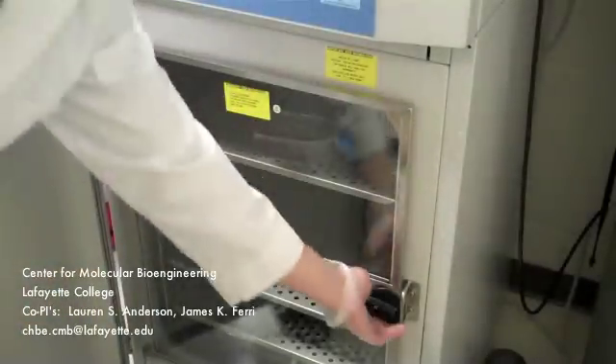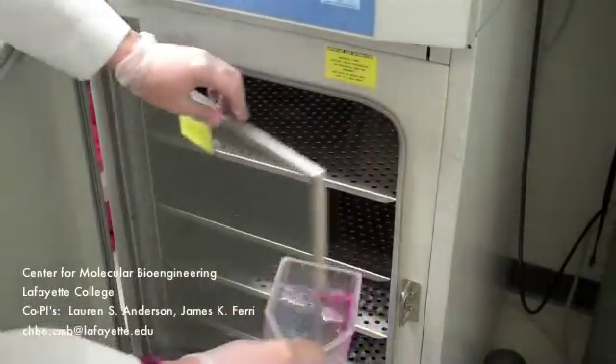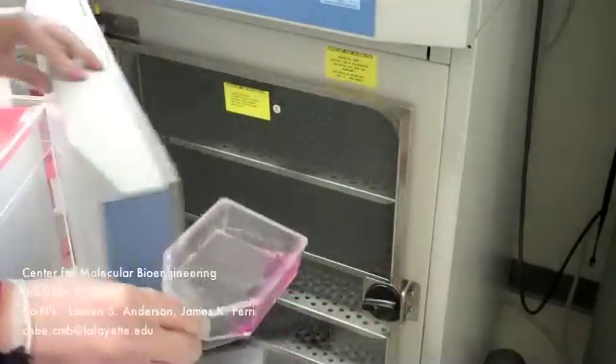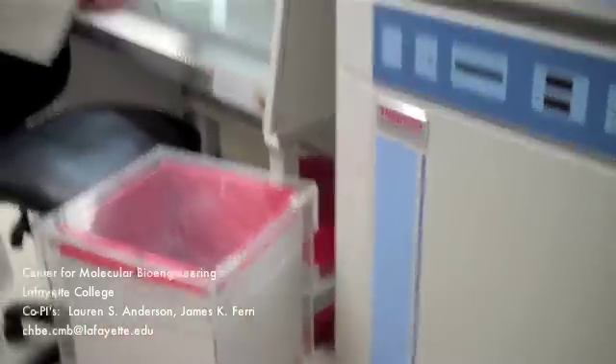Take out your T75 flask with cells from the incubator. Be very careful not to contaminate anything when placing or removing items from the incubator. Do not cough or sneeze in the incubator. To ensure extra caution, do not talk when the incubator door is open.